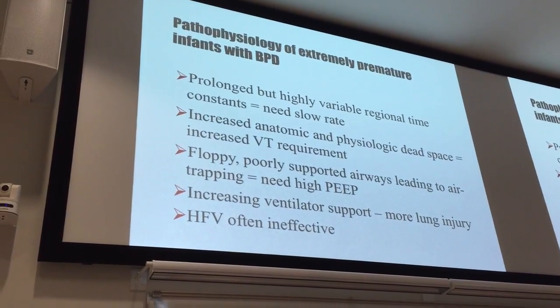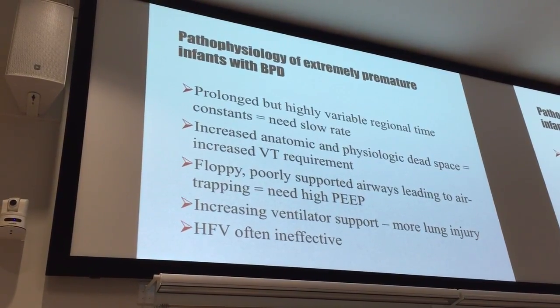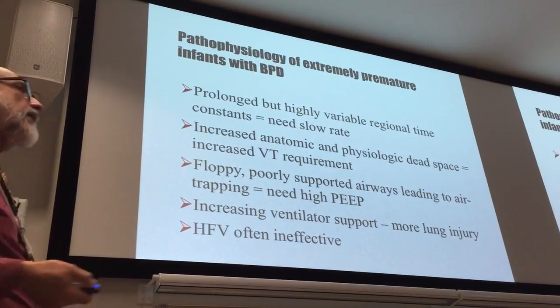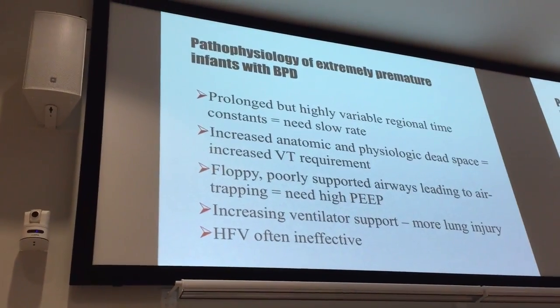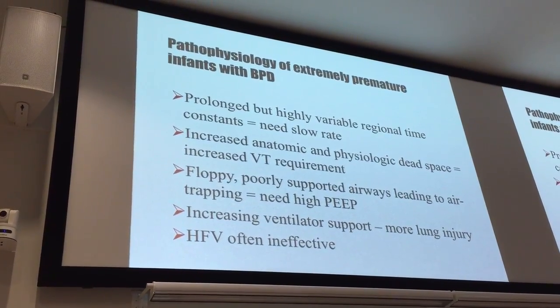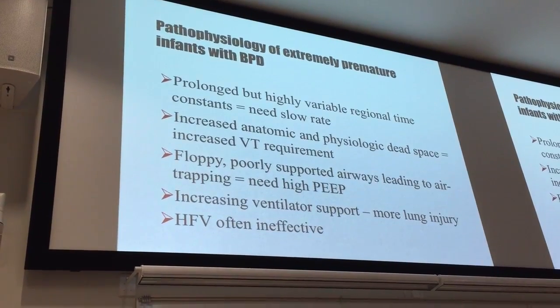Babies try to ventilate BPD babies on volume targeted ventilation on 5 per kilo. It doesn't work. They switch them to pressure ventilation. Oh, it looks much better. I say, well, what tidal volume are you generating on your setting? Oh, it's 9 per kilo. Well, no wonder 5 didn't work. So the pathophysiology is different, the tidal volume requirement is different. So again, use the tool the right way. It's not the tool, it's us.